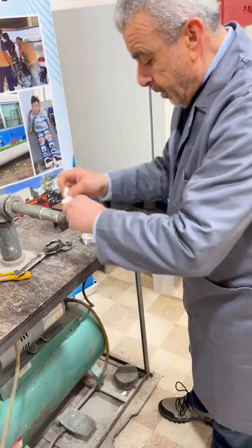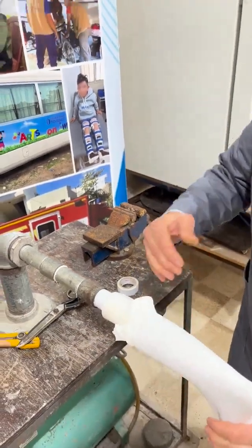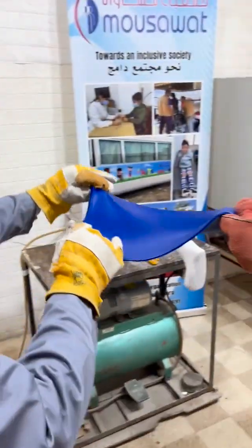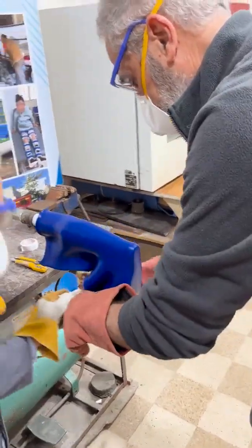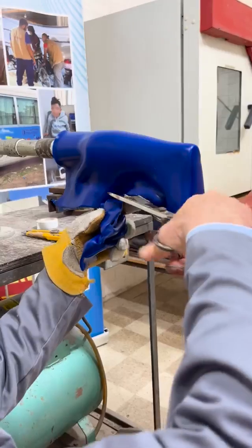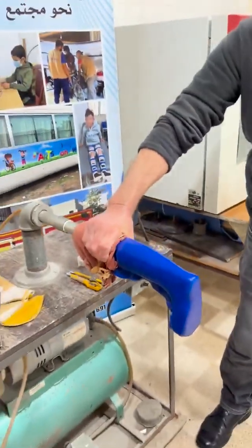For bigger models we use a bigger stockinette, but still very thin — it does not add any volume. Pull it together; you can do it with one person only. Just grab there, cut with the scissors, and then apply the suction. That's it.